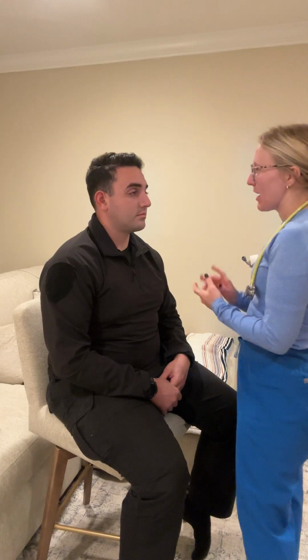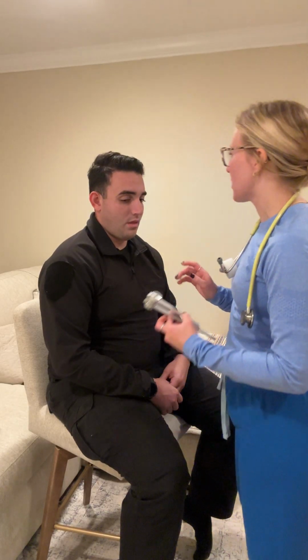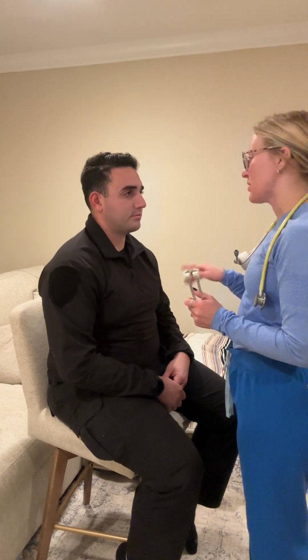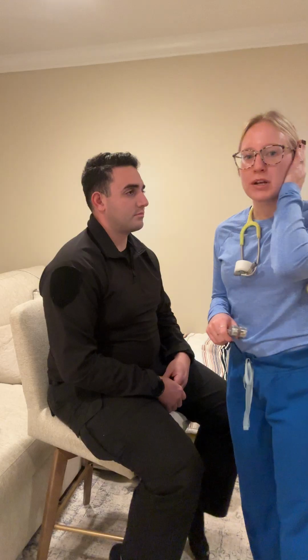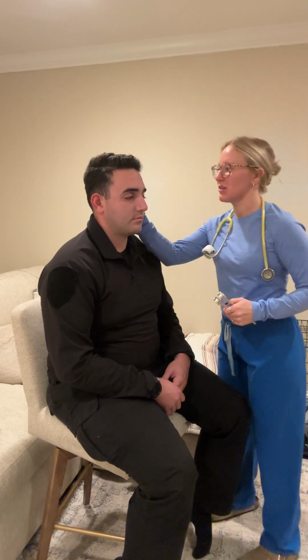What I'm going to do now, I have a few tests to test your hearing. We're going to test something called the whisper test and then the Rinne and the Weber test. So the whisper test, we'll do that first. What I'm going to do is cover one ear at a time. We're going to whisper something and see if you can hear it, okay? So I'm going to cover this side.